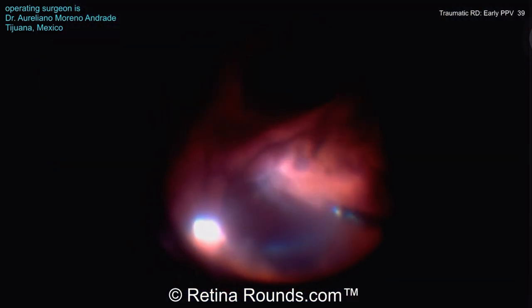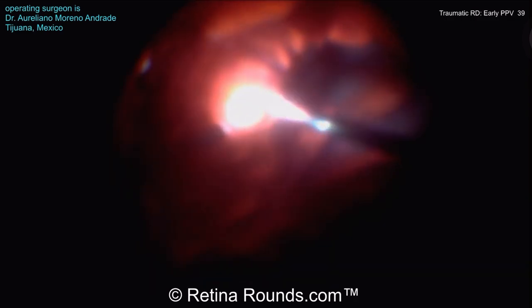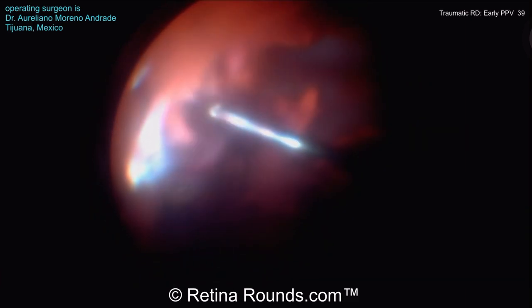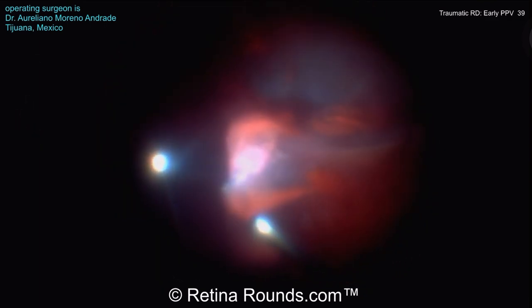Now, it looks like a lensectomy and I believe a capsule removal has been performed, and now he's moving on to the vitrectomy. And you can see here one of the complicating factors that often arises in traumatic retinal detachments is just the disorganization of the anatomy. There's quite a bit of blood here. It's hard to tell what's what.